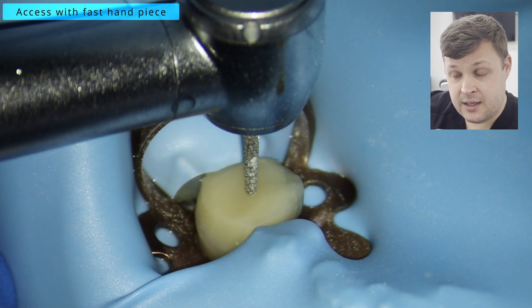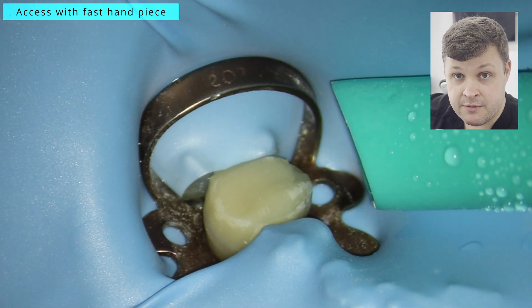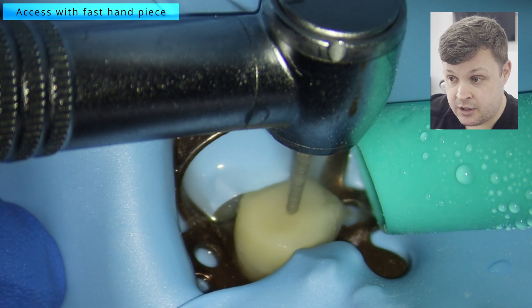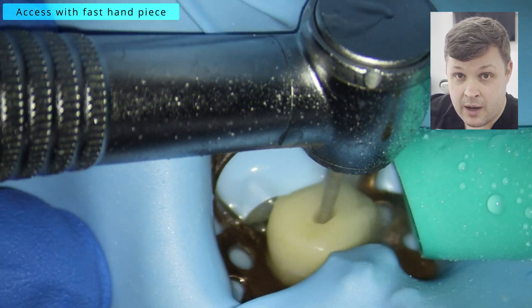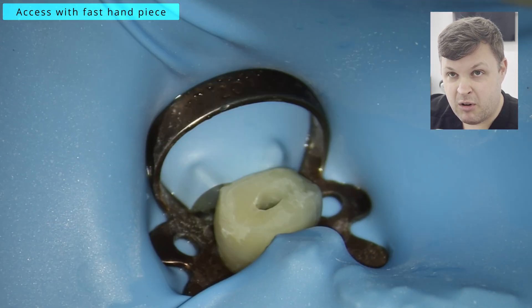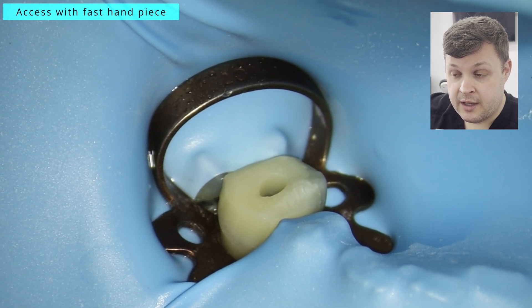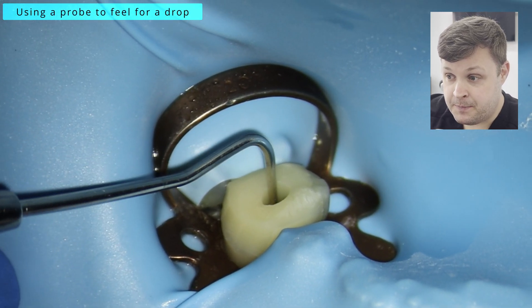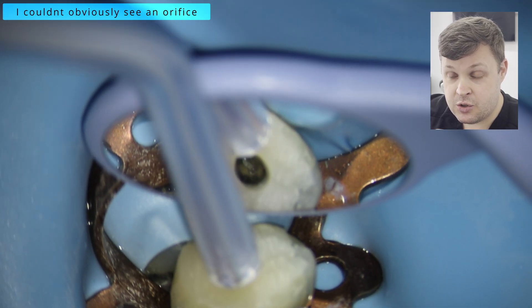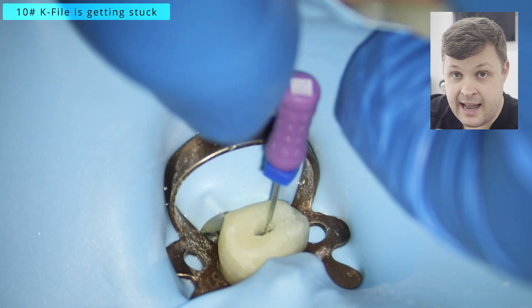What I haven't recorded is the pre-preparation for this tooth. What I have done is completely removed the old filling and placed another composite filling in its place. I've done this trick where I basically fill the whole cavity space with composite rather than creating a little hole, and that creates a nice monoblock for me to work with. I'm quite confident to access this tooth. I've just removed the composite filling here and I'm using a little probe to have a feel around.